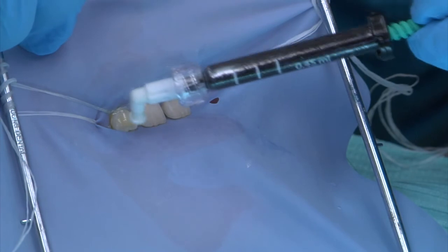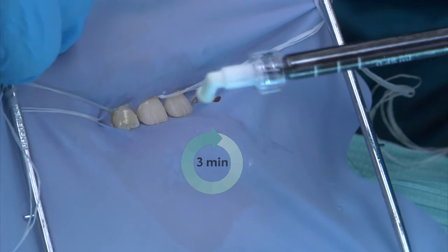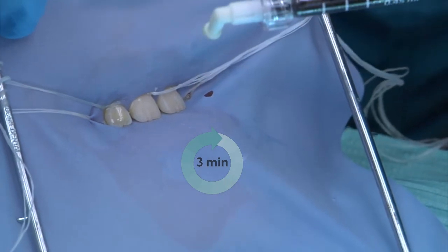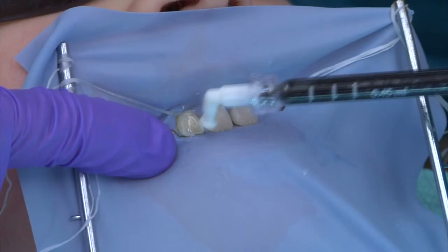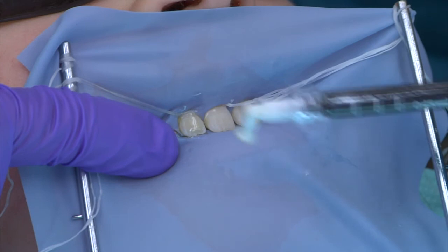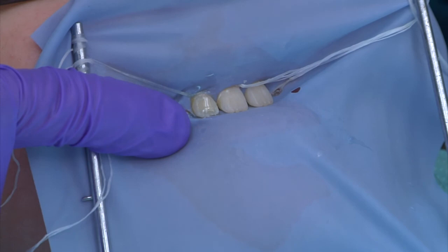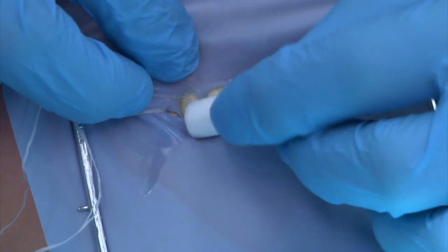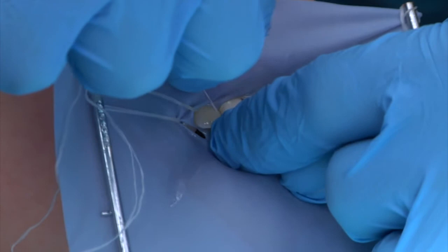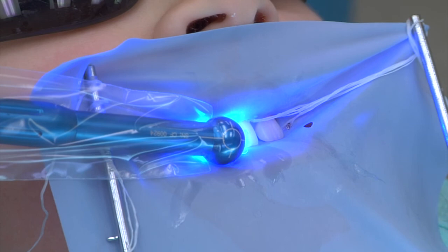The infiltrant is allowed to sit over the 3-minute period while the resin penetrates into the affected area via capillary action. Be sure that the lesion surface appears wet at all times during the 3-minute infiltration. If necessary, apply additional infiltrant to ensure that the entire surface remains wet. Following the infiltration step, excess material shall be wiped off with a cotton roll. Additionally, be sure to clean the contacts of adjacent teeth with floss to avoid bonding teeth with excess resin. Then, the resin infiltrant is light cured for a period of 40 seconds.